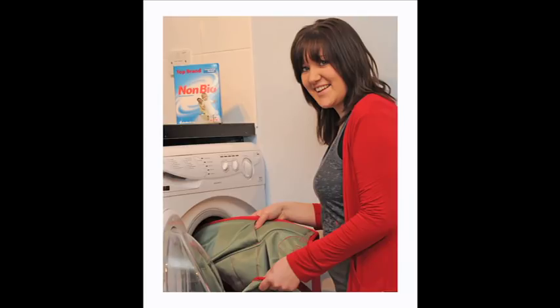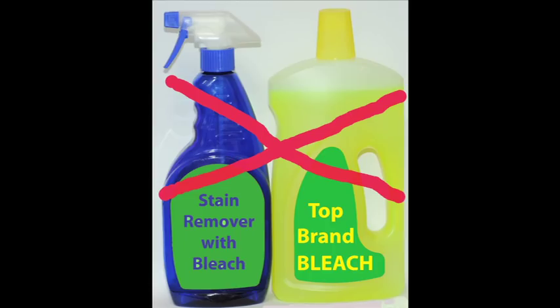Wash the sling according to the instructions on the label and in the user guide. Washing at 40 degrees with a non-biological detergent will clean the sling. Higher temperatures may be required if infection control is an issue. See the sling's user guide for further details. Never use bleach — it can weaken the sling and lead to sling failure.